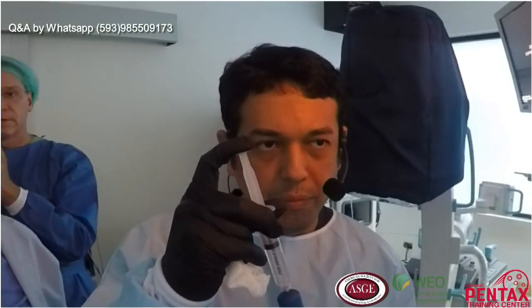Now I will inject. You see? Perfect. I am in the cavity. You see here? You see? It is everywhere.